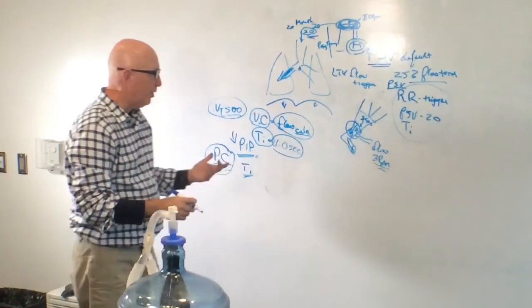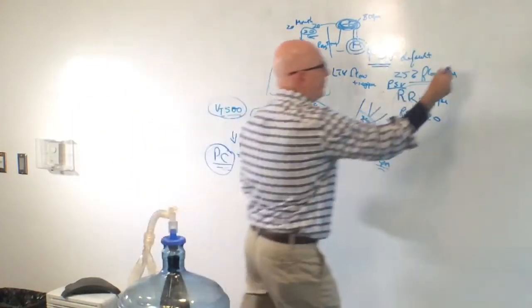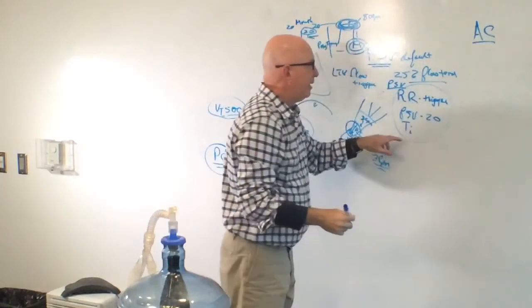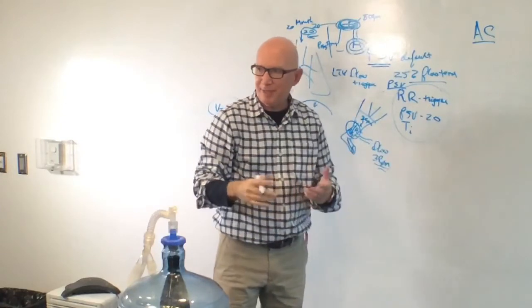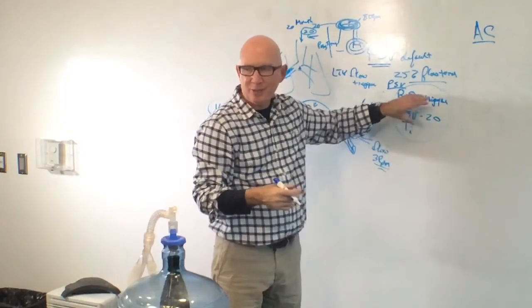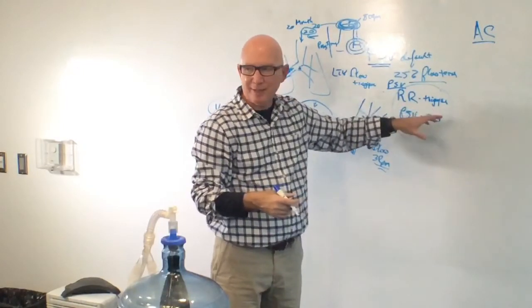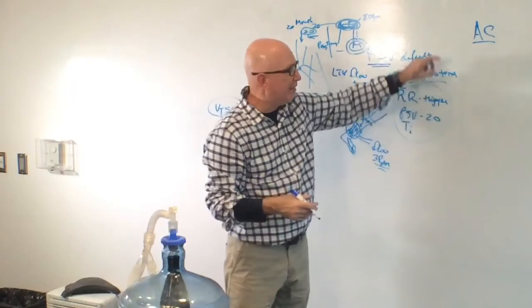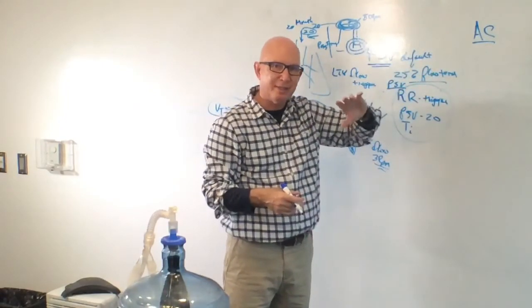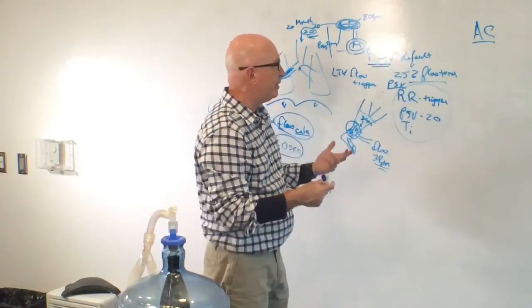I think we should also talk about the AC piece though, because this actually can create some other problems for you. So if your patient is breathing, and that's why PSV breathing will work nicely for patients, and that's why I'm pleased that it's part of your strategy for ventilated patients with an intact respiratory drive. Because if you're in AC and someone has an intact respiratory drive, and I'm not suggesting you can't ventilate them, but in AC there's a couple of things which create some problems.